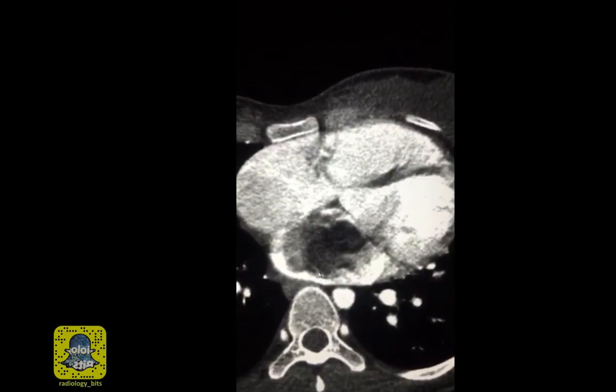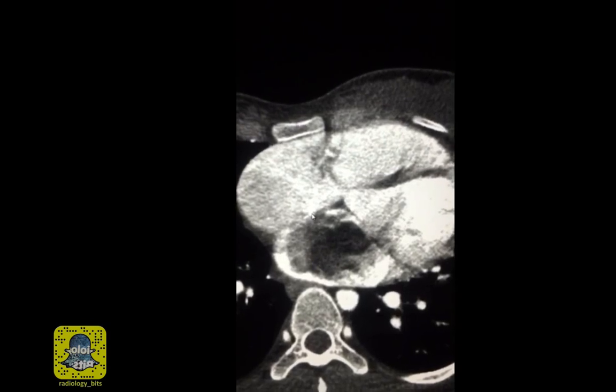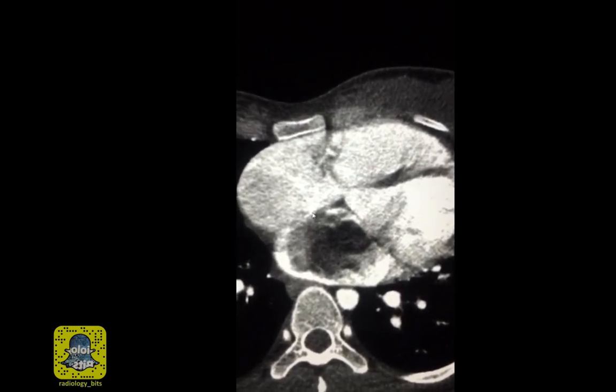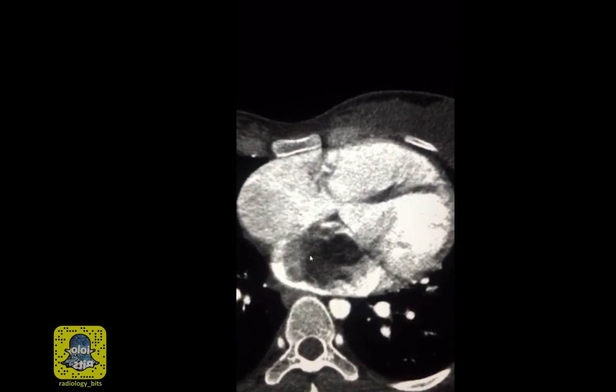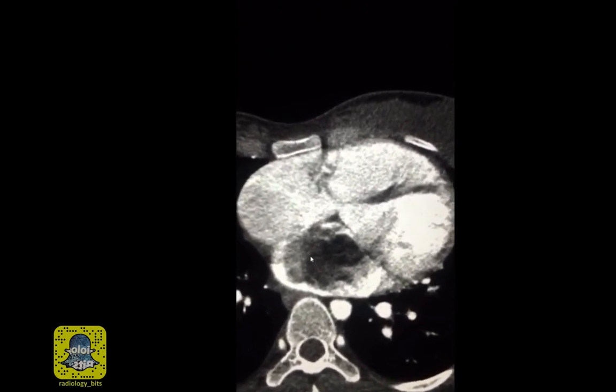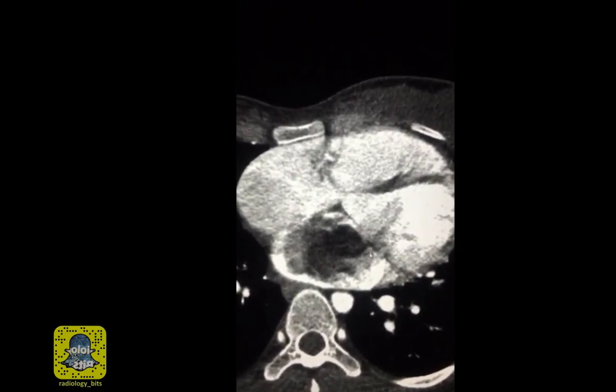Although thrombus is the most common, in a young patient who has no risk factors, she was healthy before, a primary cardiac tumor should be considered. Given that primary cardiac tumors are more common in the form of myxoma, you'd favor that over a sarcoma. Add to that, myxoma is usually confined within the chamber.